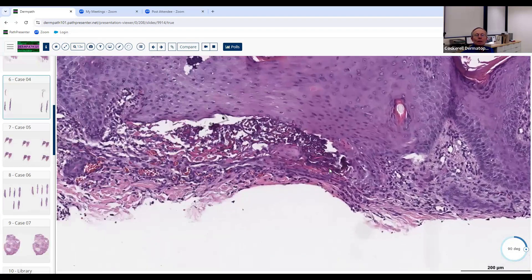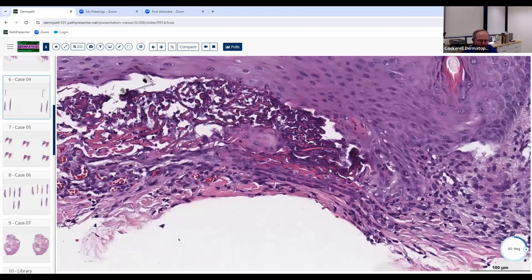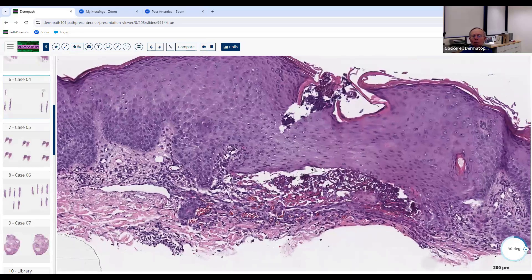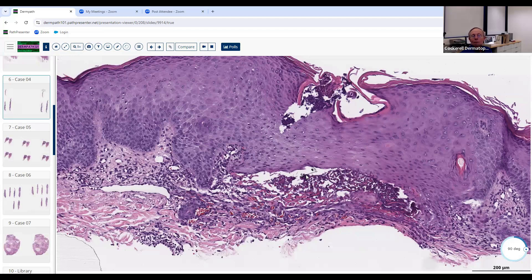This is a nice example of elastosis perforans serpiginosa, which is in the family of perforating disorders. All perforating disorders require some epidermal alteration for perforation to occur — it doesn't happen spontaneously. For example, patients with chronic renal failure who are very itchy will scratch their skin and develop areas of transepidermal elimination. If those patients end up comatose and stop scratching, the lesions eventually go away. You must have some damage to the epidermis to get perforating disorders.